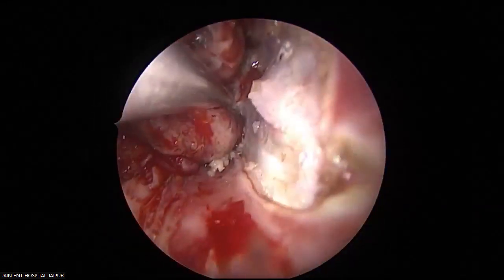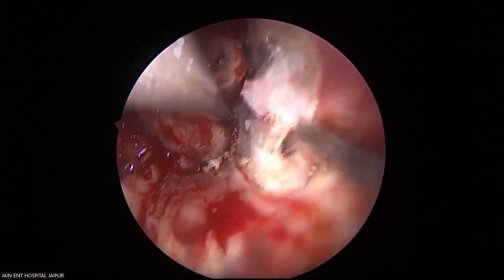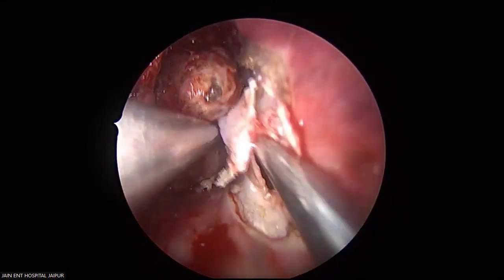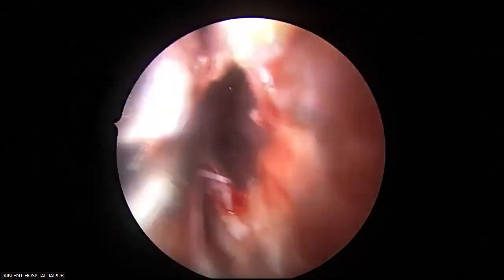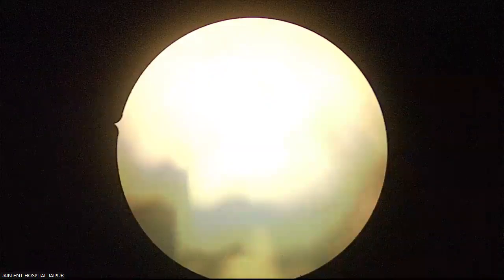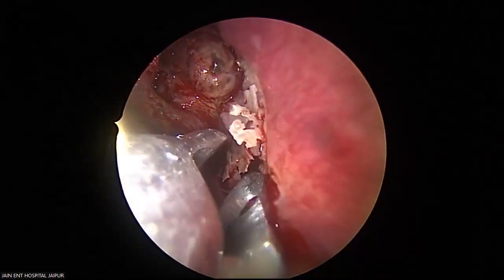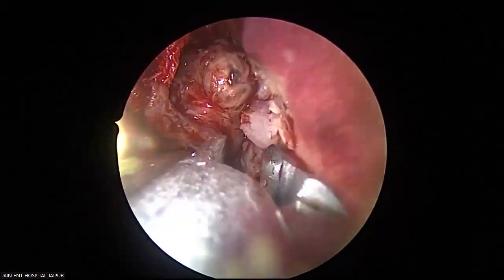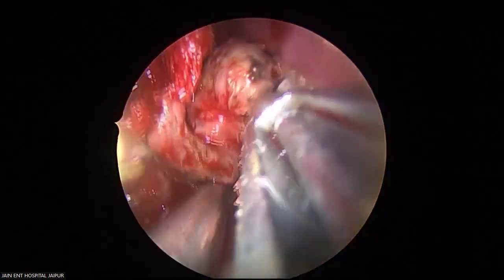See this. This will give me opportunity to control the tumor from medial side, from behind, everywhere. See, you can go to the opposite side. So that's a very important part of the tumor control as well as tumor delivery.